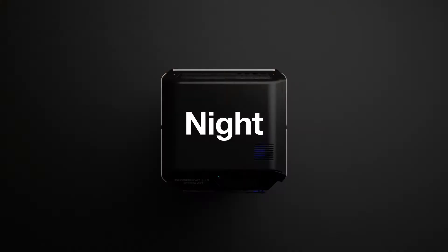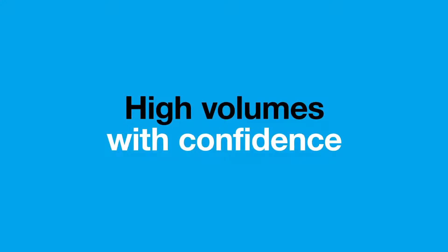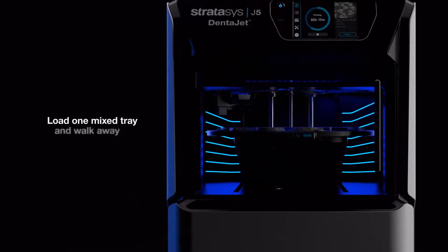Print day or night in high volumes with confidence. Simply load one tray and walk away.